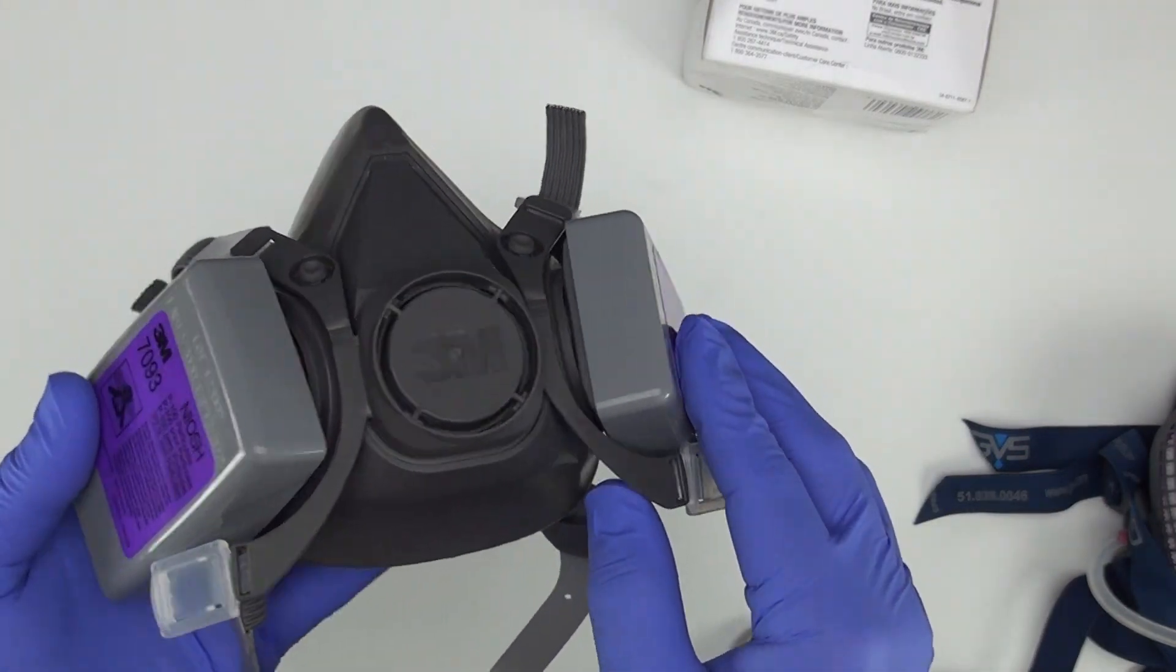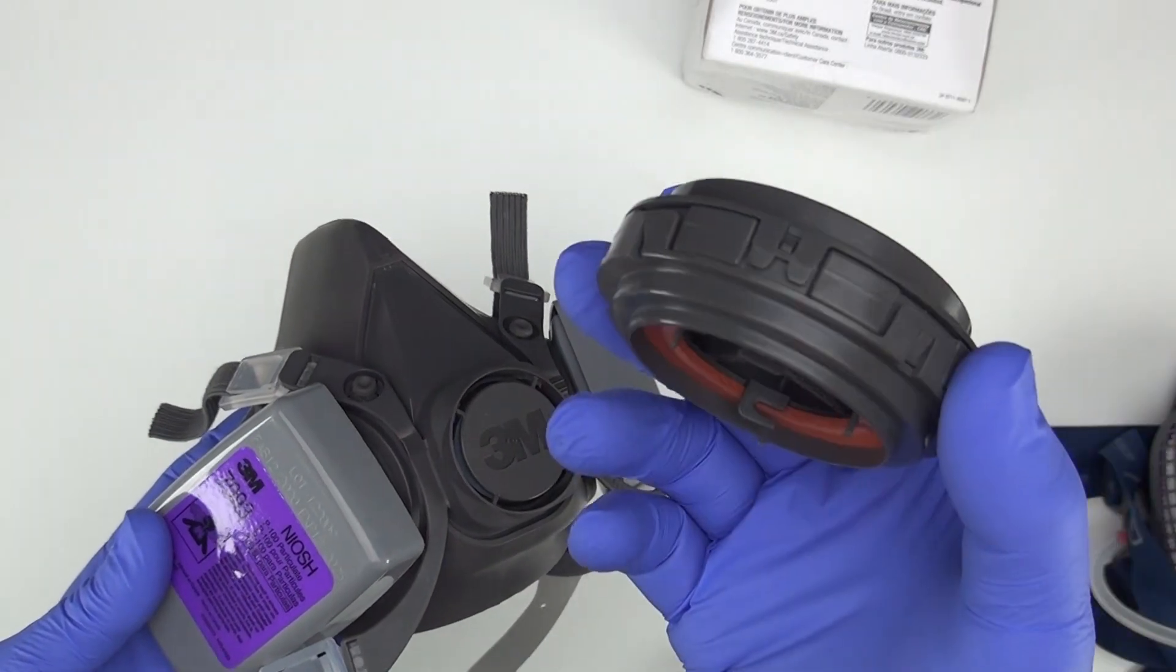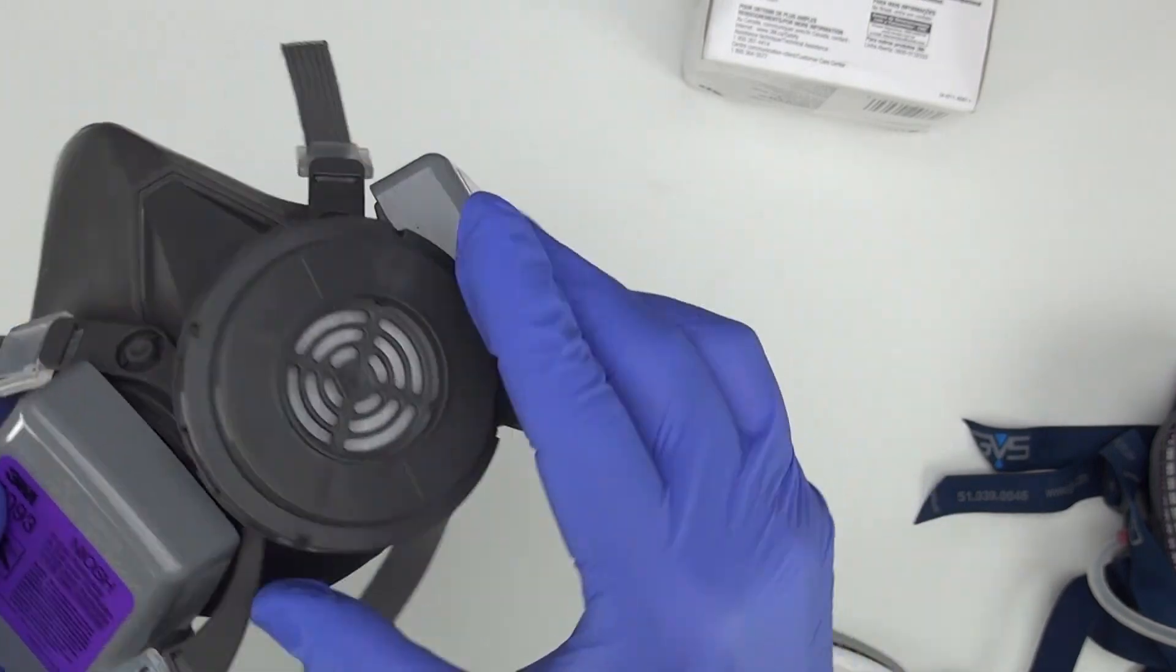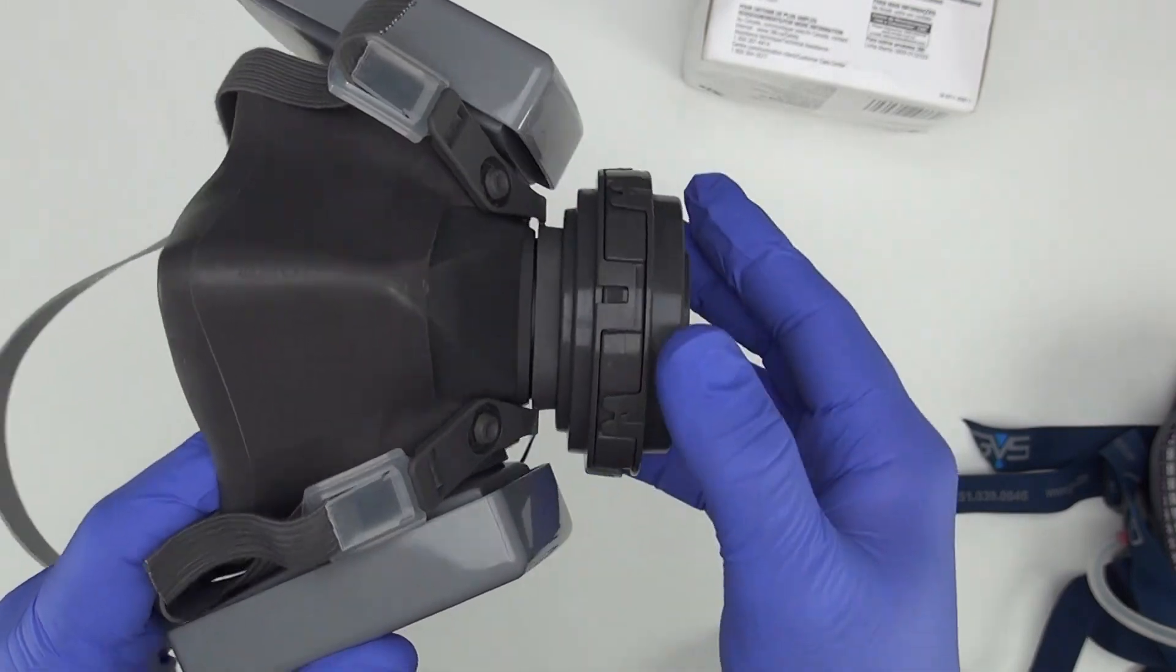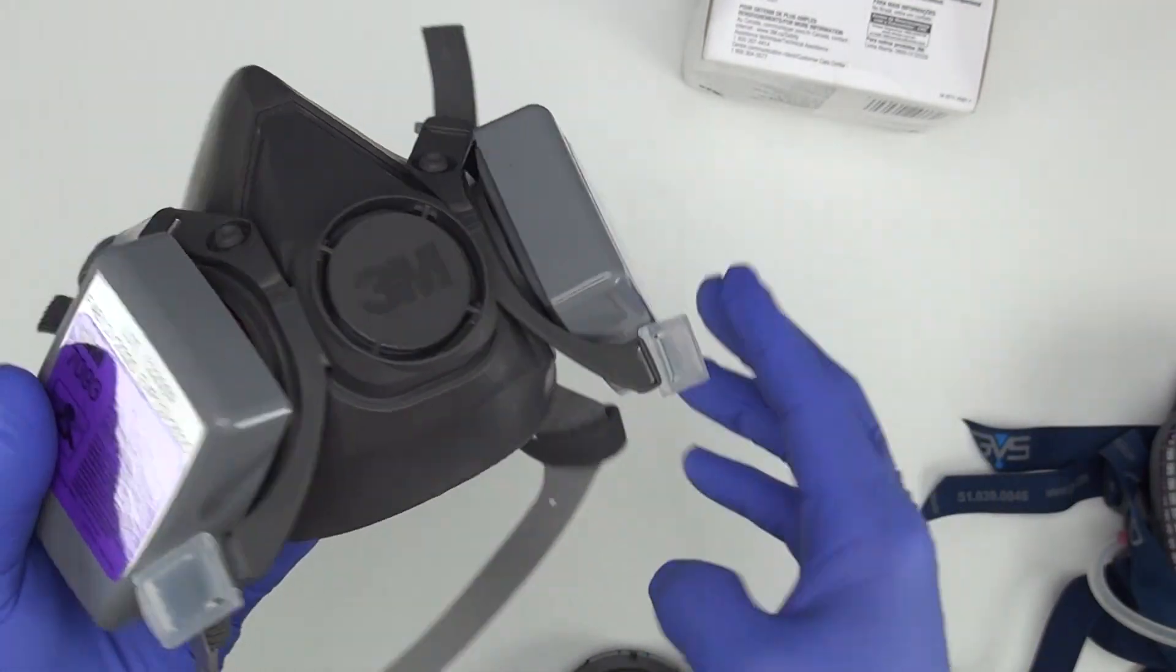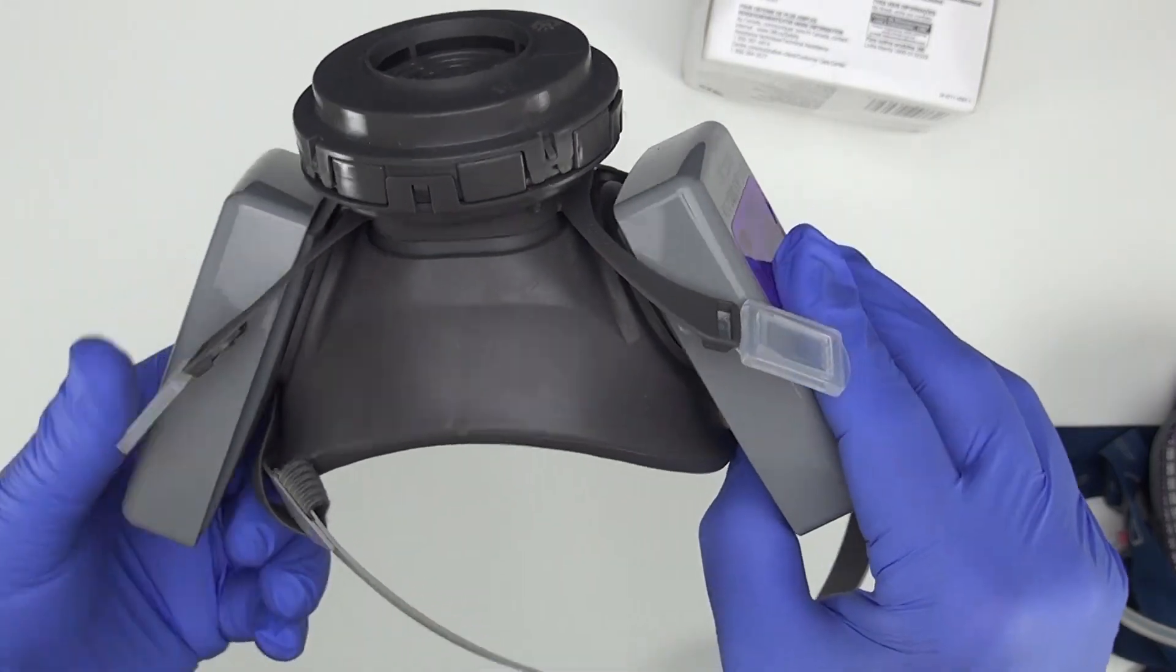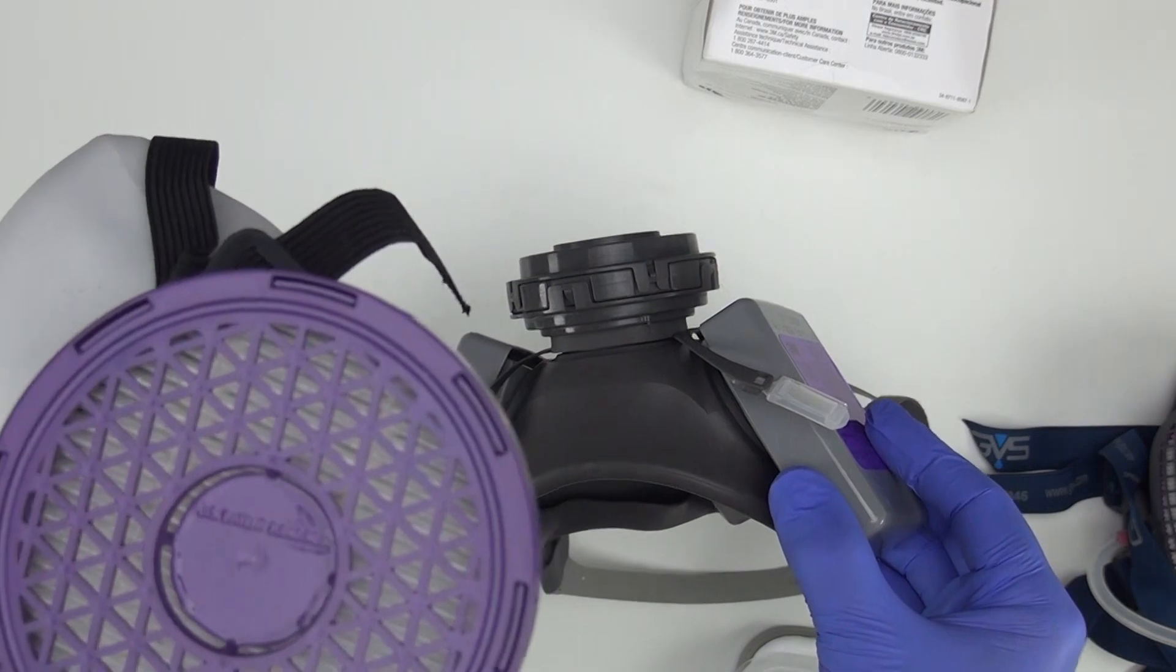Getting back to the 3M, you can make this into a source control mask. You can buy this separate 604 exhalation valve filter. By putting it on the exhalation port, you can create a source control mask. And when you don't need a source control mask, you can take this off. But it does make the mask bulkier. You now have kind of a gigantic mask. And it's not quite as easy to breathe through these P100 filters as it is the Dentec. These are a little bit more breathable.